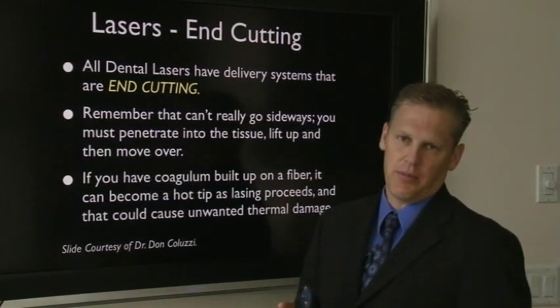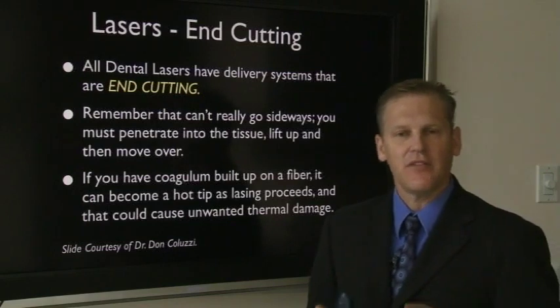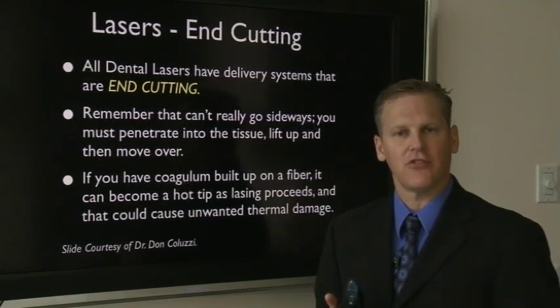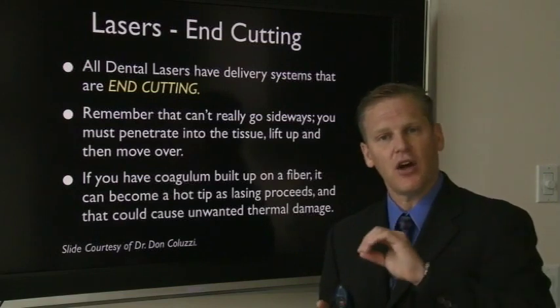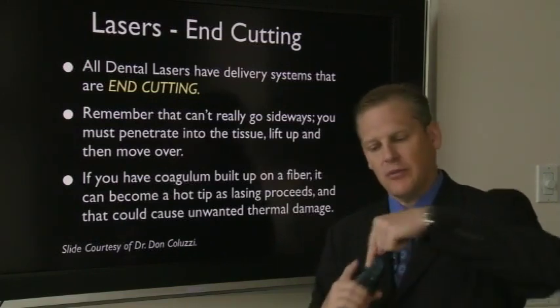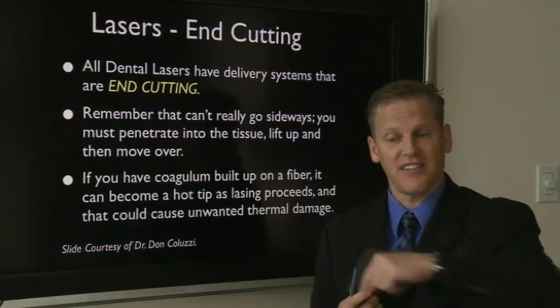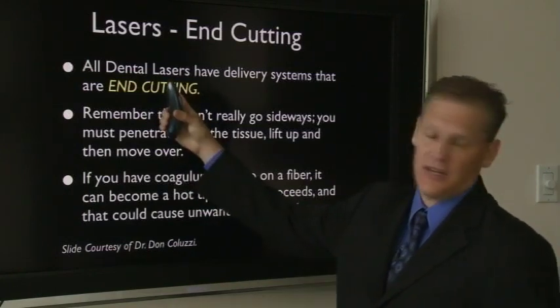One key thing to remember with all lasers is that they are end cutting. It's an important concept to grasp. It is one of the things that makes lasers more difficult for the average dentist initially. The reason is that when you use the laser, you cannot really use the sides to cut through. Unlike a burr, where you are able to use the sides or periphery of the burr to cut, or even a scalpel, where it's the process of dragging that causes the cutting. Lasers are all end cutting.